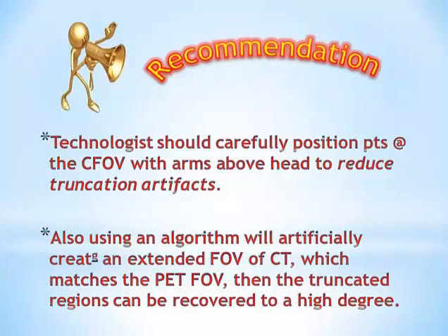So again, technologists should carefully position patients at the center of the field of view with arms above their heads in order to reduce the truncation artifact. Also, using an algorithm that artificially creates and extends the field of view of the CT, which matches the PET field of view, the truncated regions can be recovered to a high degree. So that means you are playing on the computer in order to get the missing part.